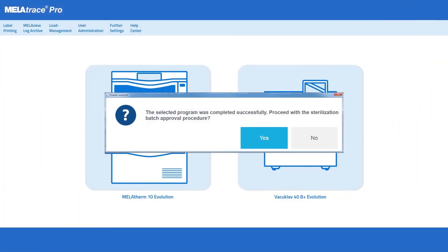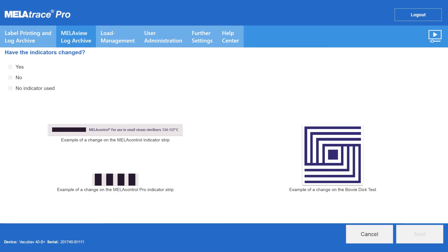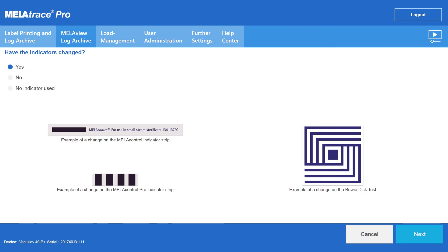The instrument decontamination process ends with approval and labelling. To do so, document the result of the batch indicator and then provide the batch with approval.